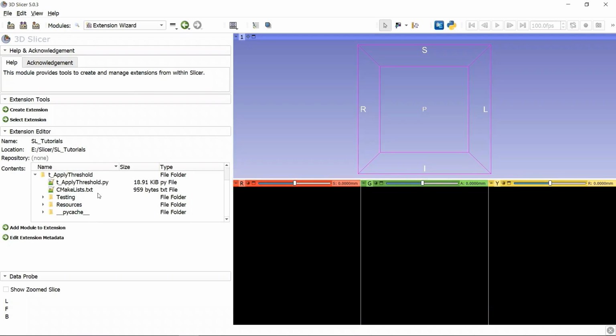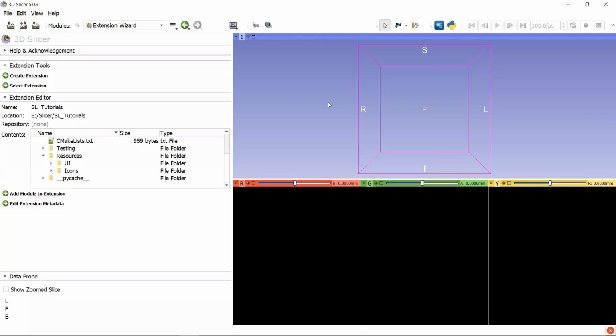Besides this CMake file, there is one Python file, which is the most important file we will be working on. There are two subfolders. One subfolder is called Testing. It's for running unit tests of the module. We can just keep it here, and no need to change it. The other folder is called Resources. This is where you can change the icon of your module, or you can edit the GUI of your module. OK, we are done with the extension wizard.